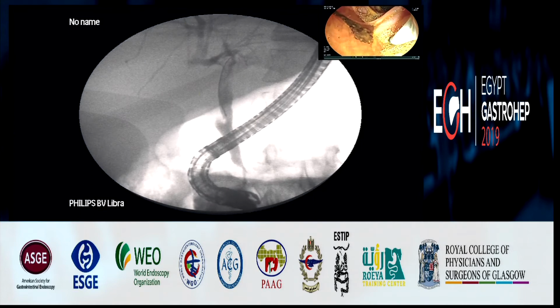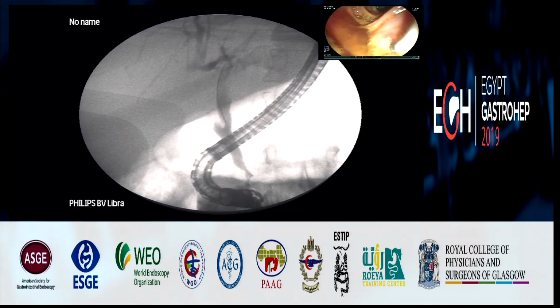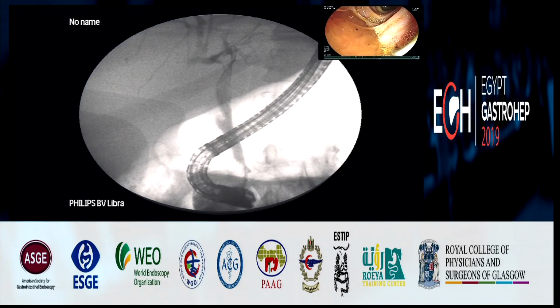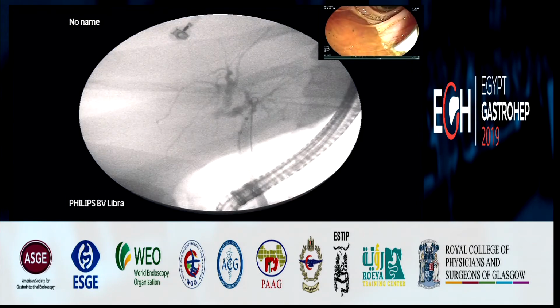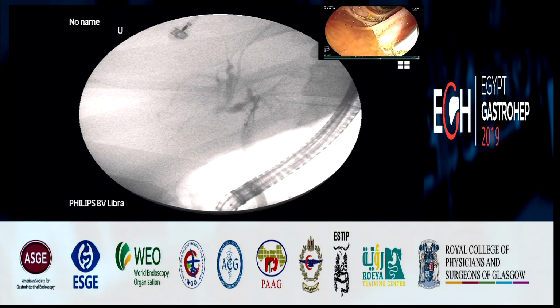The cystic duct is in the middle. But I don't see any more stricture at the level of the cholecystectomy. Yeah. And I'll go up one last time, so we can go up again on the guide wire, just to see if everything passes nicely. But what I will do in this case, I would not fluoro again the intrahepatic ducts. Yes, the intrahepatic duct, the left side seems a bit like PSC, attenuated, like a dead tree.